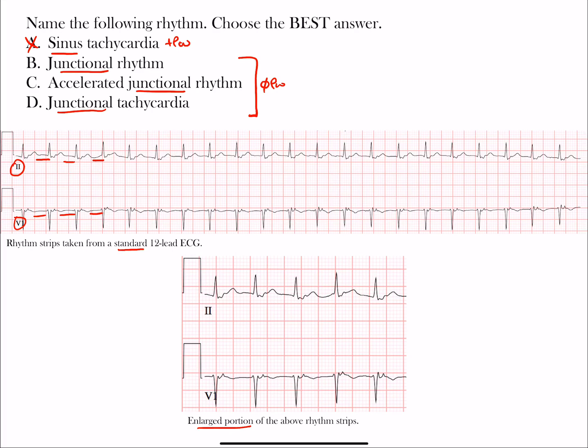How do you differentiate these junctional rhythms? A regular junctional rhythm has a rate between 40 and 60 beats per minute. An accelerated junctional rhythm has a rate between 60 and 100 beats per minute. Junctional tachycardia, like any other tachycardia, has a rate above 100 beats per minute.